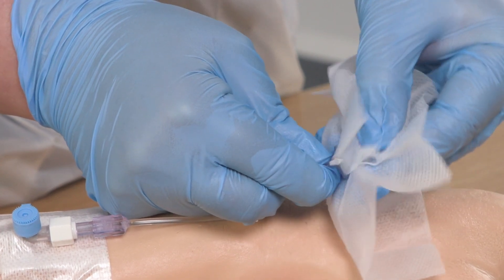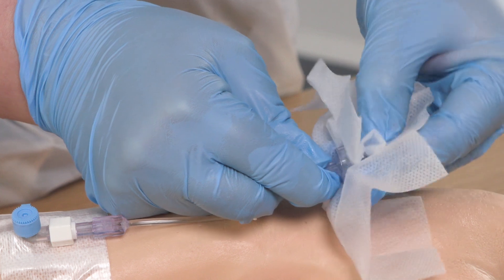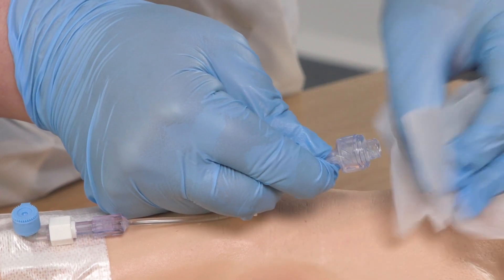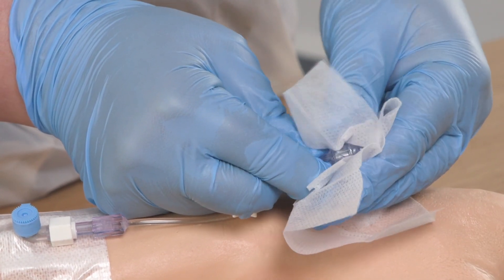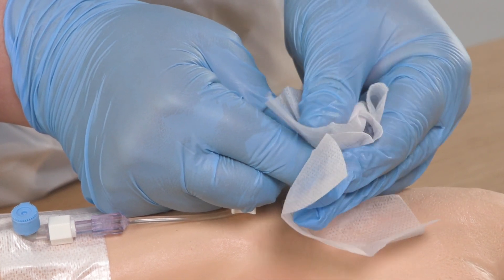As it is a luer lock connection on the device there are small threads on it, so you really want to give these a thorough scrub to remove any extrinsic microorganisms present. I now need to let that solution dry for about 30 seconds. An effective scrub the hub technique is vitally important as the needle-free access device is sitting on the patient's skin and can get contaminated easily. So we need to do everything we can to decontaminate it thoroughly in order to reduce the risk of bloodstream infection.